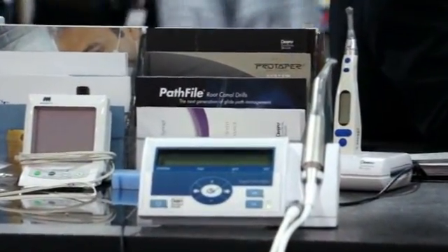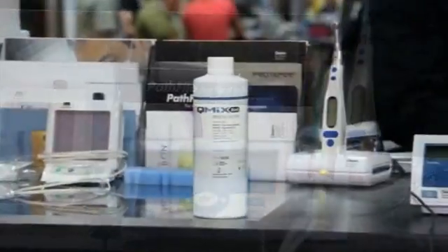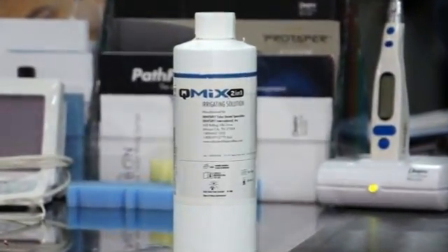Today we're talking about a new paradigm in endodontics when it comes to cleaning and shaping. When it comes to shaping, we have a new system that is a one-file technique called Wave 1, and we also have a new irrigation solution for cleaning, which is called QMix.